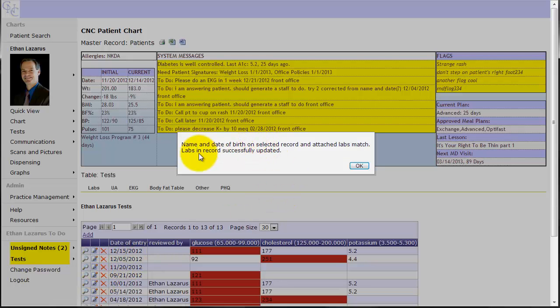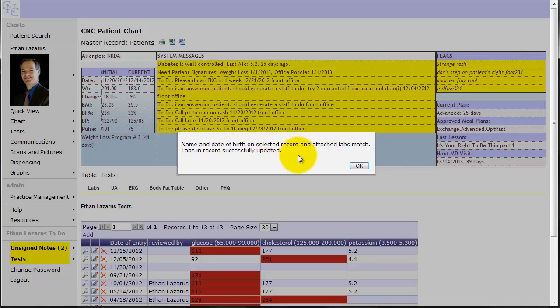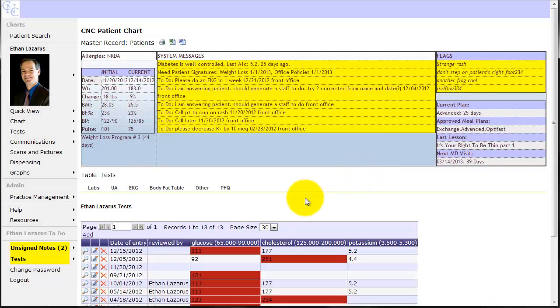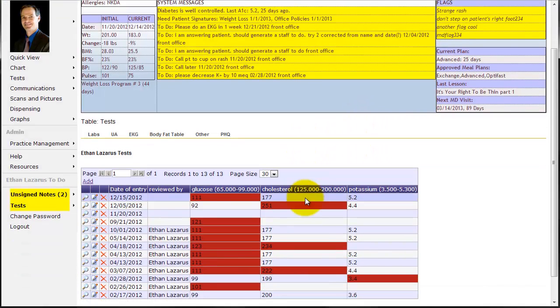Here's a message from the computer for me. It says the name and the date of birth on selected record and the attached labs match. The labs in the record were successfully updated. So I went ahead and checked for a name match and a birth date match. Now if it doesn't find those, it'll still go ahead and add it. But it's going to give you a warning up here in case there was a typo or something like that. Let's see what it did. So it went ahead and imported that lab file.